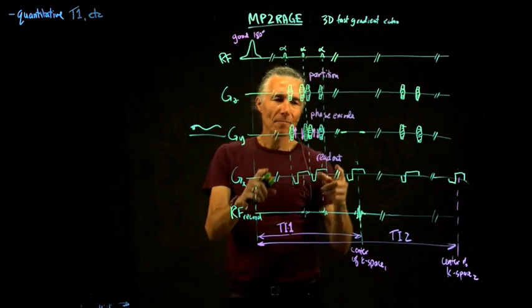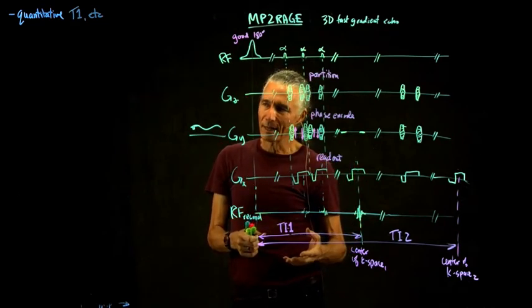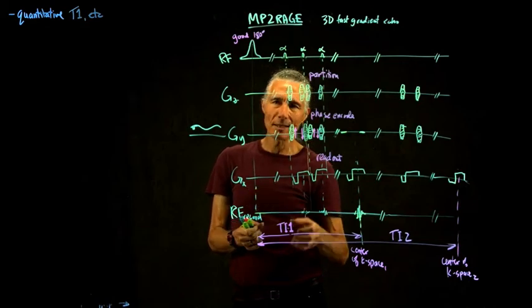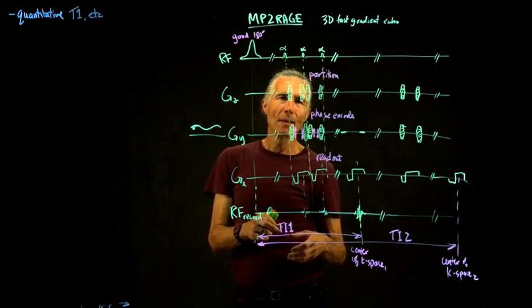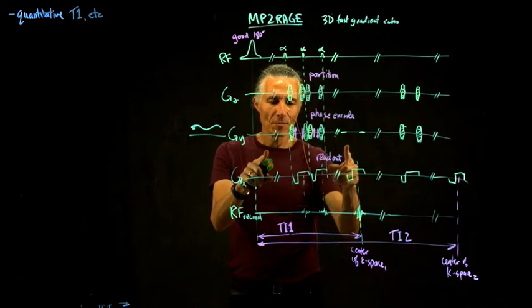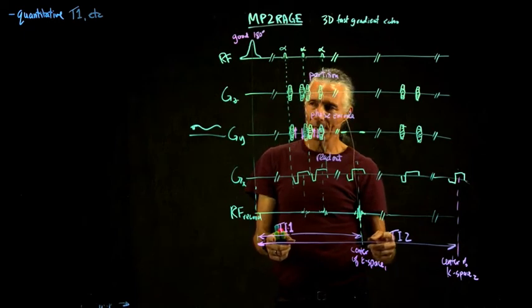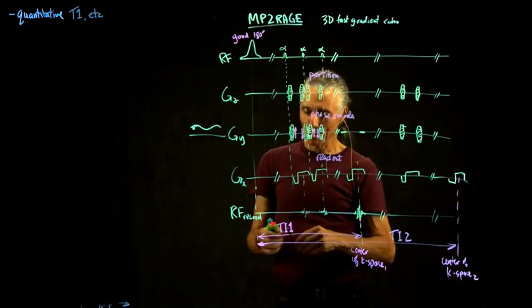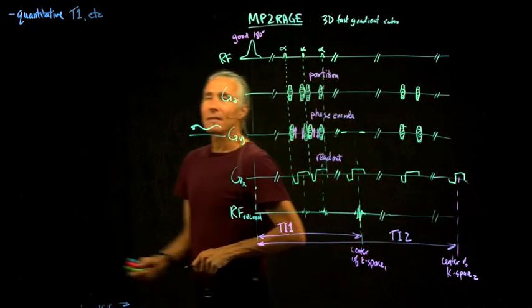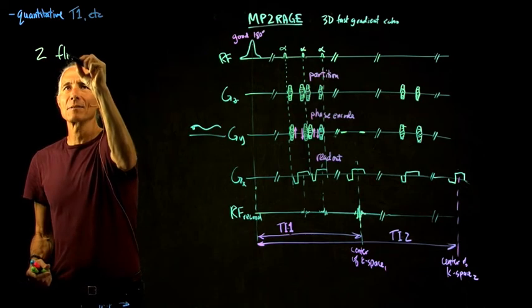There was T1 divided by T2, like they do with the HCP: collect a T1 and a T2 image and divide them by each other. Then there's MP2RAGE, which collects two complete 3D images with two different inversion times and does something to them. And then there's the one that I was involved with.